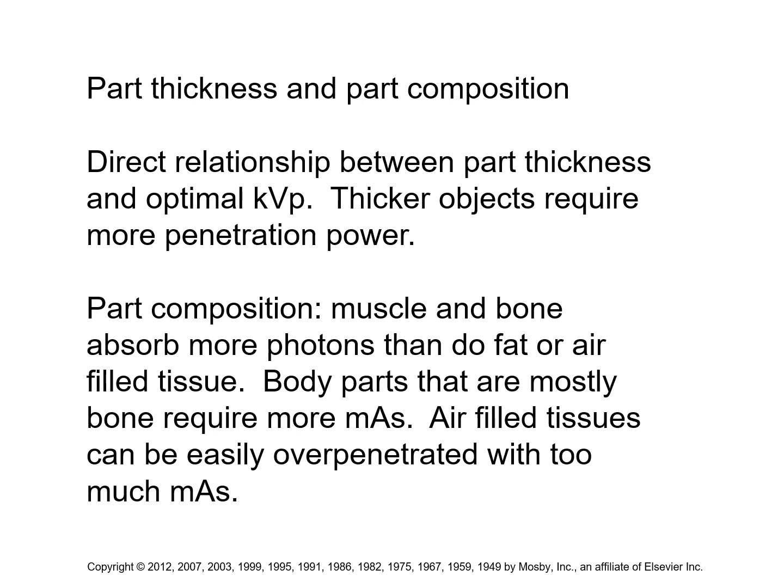Wrong. The knee is 90% bone, right? And then there's some muscle and connective tissue. The neck is probably about 60-40 ratio, 60% muscle, 40% bone. Okay, and then there's cartilage and connective tissue, right? But the ratio of bone to soft tissue is very, very different for the neck and the knee.